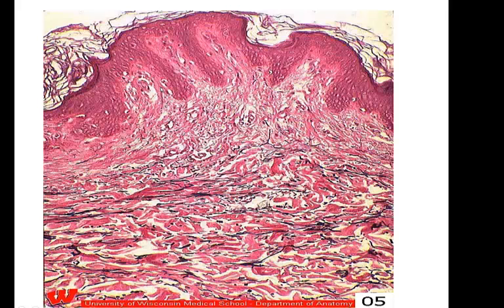Here is that layer. This is kind of a real far away picture. This is the layer right here, and I'm outlining the bottom of the layer of stratified squamous epithelium, and the layer will go from here all the way out. And so this stuff out here is the dead outer portion of your skin that flakes off. You can think of it as dandruff or dry skin. So from here out, this is stratified squamous epithelium, but we would say that this is keratinized stratified squamous epithelium.